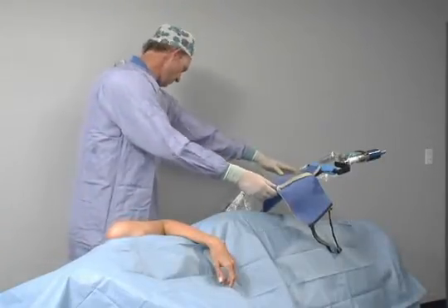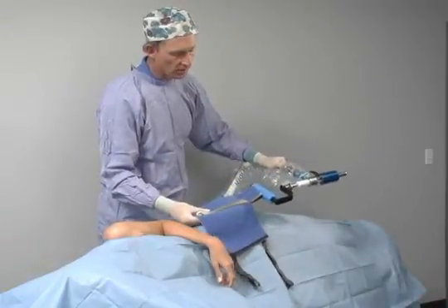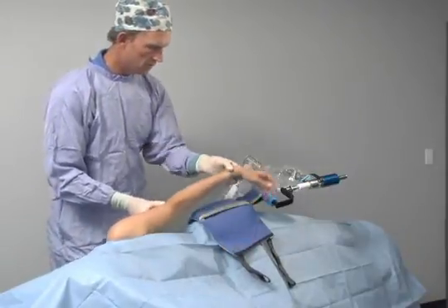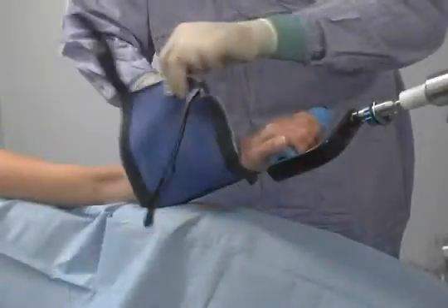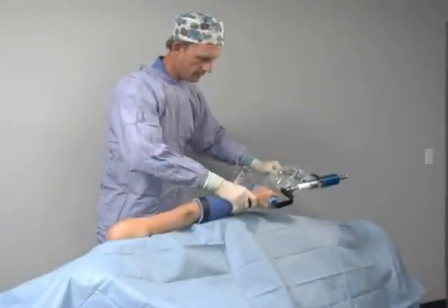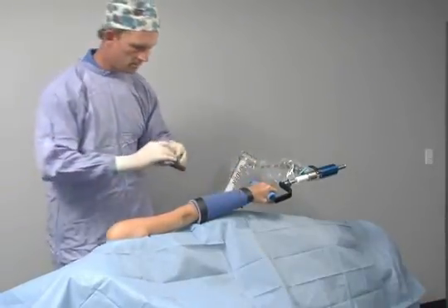After the lateral shoulder bar and kit are connected to the spider, the spider joints are released and the lateral shoulder bar is placed just above the patient's hip, so that the operative hand grasps the handle and the operative arm can be wrapped. The arm cuff is wrapped around the arm as tight as possible. The spider and arm can be repositioned for easy access during the wrapping process.